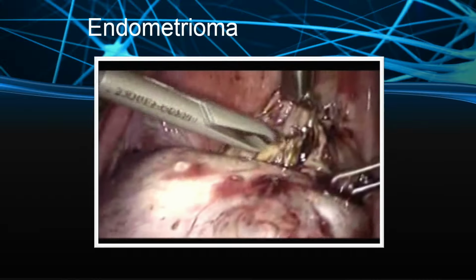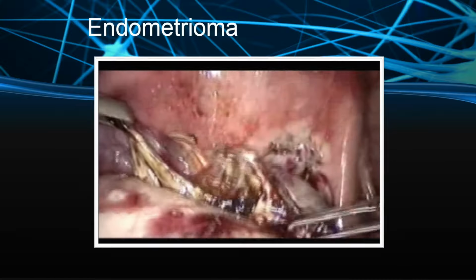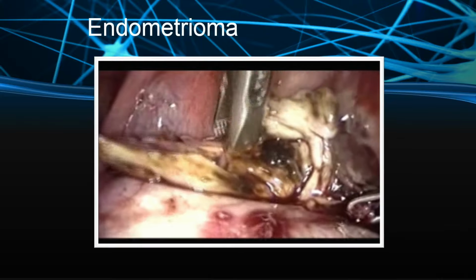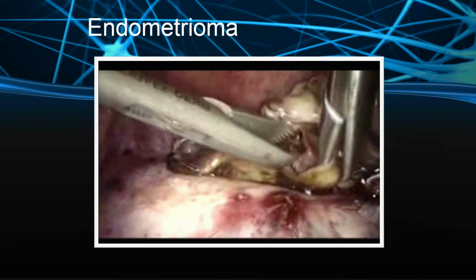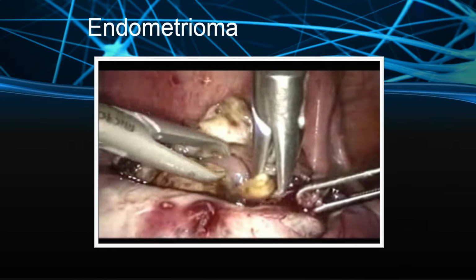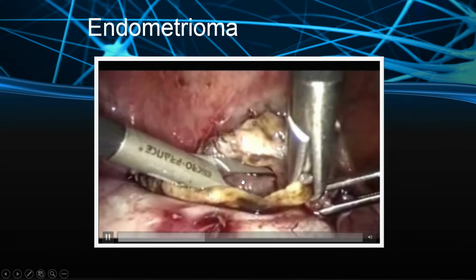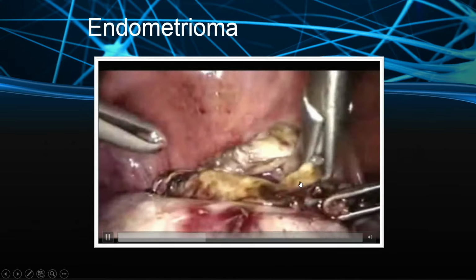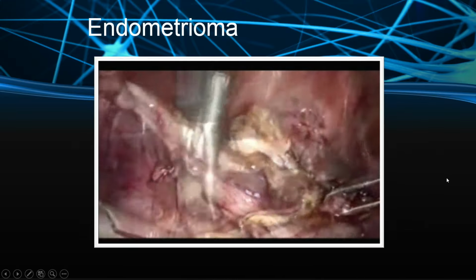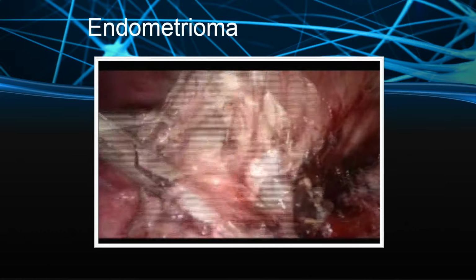In the beginning of your career, bad endometrioma you should avoid, otherwise rectal perforation can happen, ureteric injury can happen. Later with experience you will learn how to play with the tissue, and especially once your hand-eye coordination develops with a lot of practical exercises, and your suturing and knotting develop, then it will be easy. These are the daughter cysts which you puncture, these also have chocolate material that has to be taken out. So, these types of cases are very challenging, but you can do it, and the patient benefits.